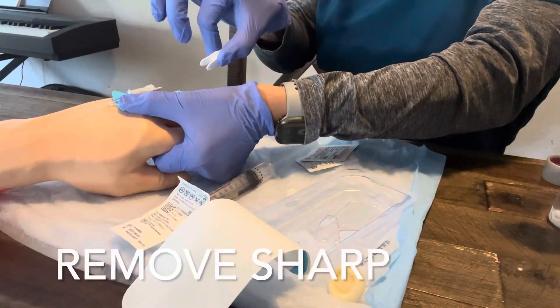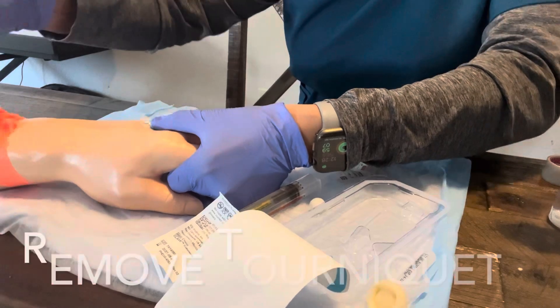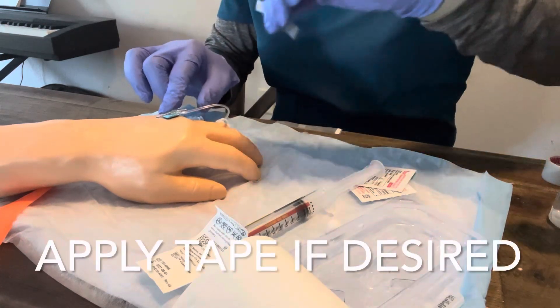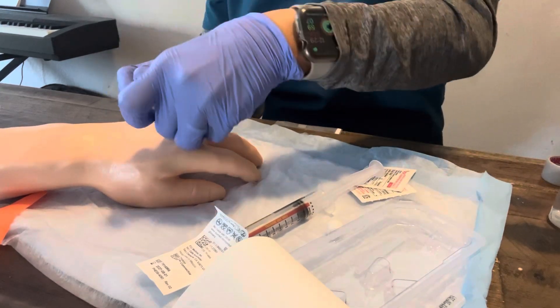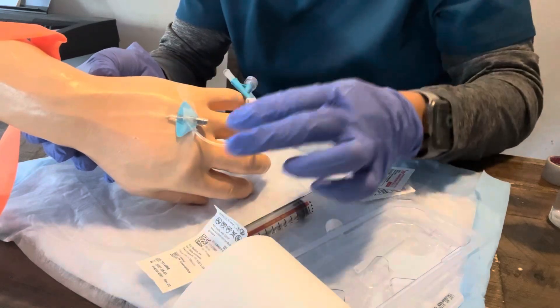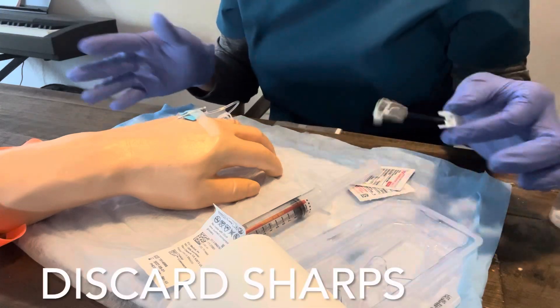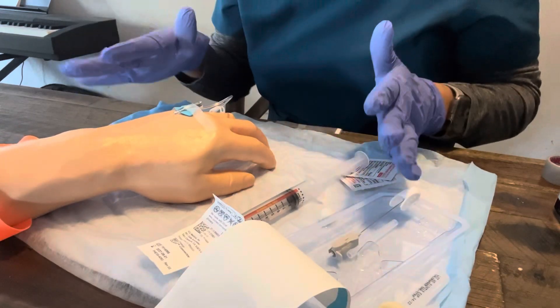I'm going to pull off my sharp. If I have a good vein, I'll have blood right here in this little pigtail. Once I'm in, I want to pop my tourniquet — that trips students up a lot because they forget to pop the tourniquet and start flushing. I'm going to use my piece of tape to anchor over the wings, ensuring I'm not going over the insertion site — only over the wings. Site looks good. I don't see any signs of infiltration, no edema. It looks like it's in place.